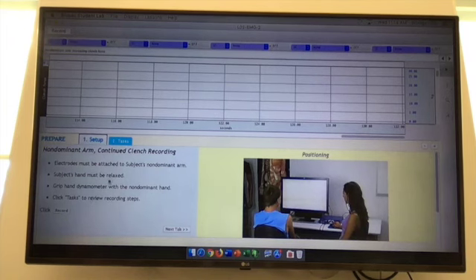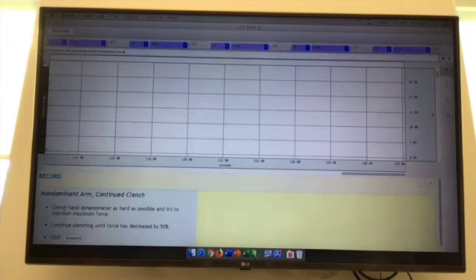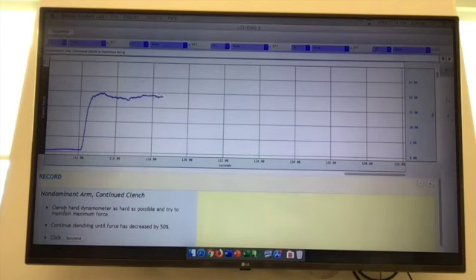And again, we're going to do the fatigue exercise on the non-dominant arm. Should have given me more of a break. We just jumped. We kind of jumped the gun there.